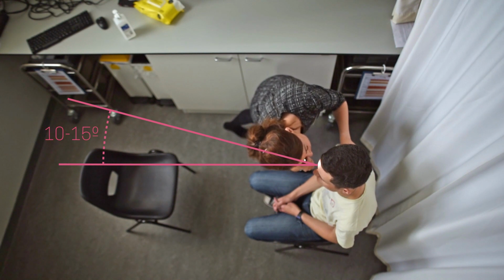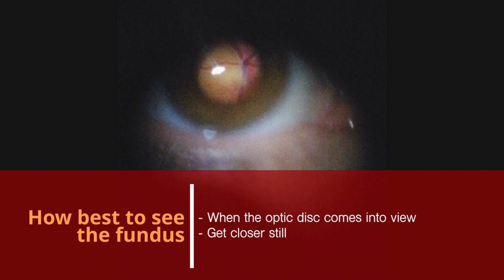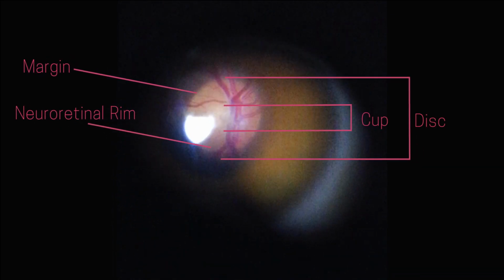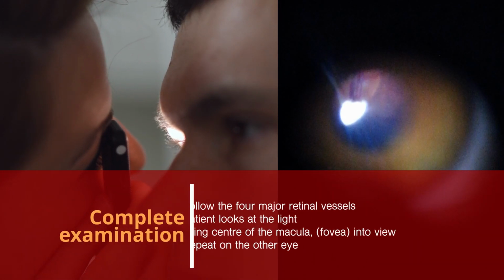When you're close to the eye, the optic disc should come into view. Go in closer still and you'll get a wider and more stable view. Comment on how distinct the margin of the disc is, the colour of the neuroretinal rim and the cup to disc ratio. Then look for other signs along the 4 major branches of the retinal vessels.